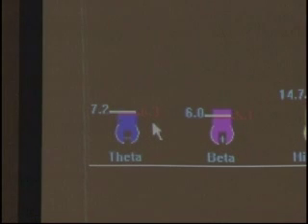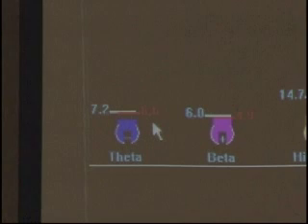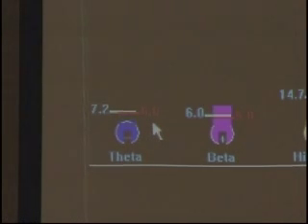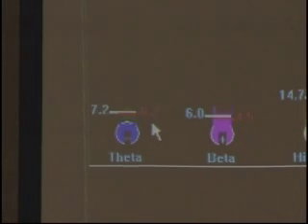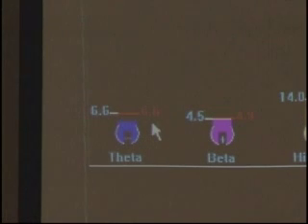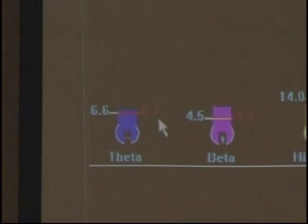We also always have the option of using the Y key to update thresholds. Watch these numbers — 7.2, 6.5, 6.6, 6.5. If I hit the Y key — do you see what happened? The thresholds came together and were the same for a moment. We reset the threshold that feedback is based on to where it needed to be to meet the target.